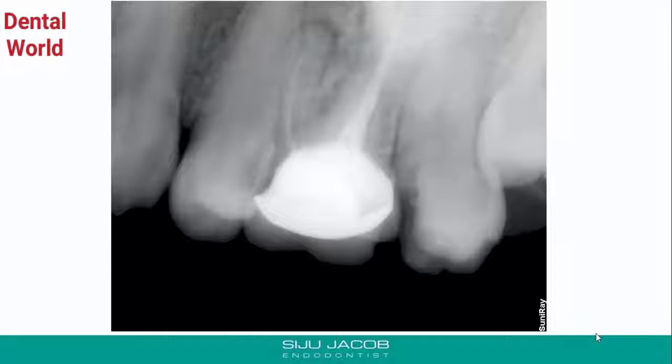Okay, so this is a good tooth or a good case to explain or convey the thought process that goes through my mind when I treat a calcified tooth or a difficult tooth. So let me just take you through the various stages of what happens when we treat such a tooth. Okay, so I first saw this case.